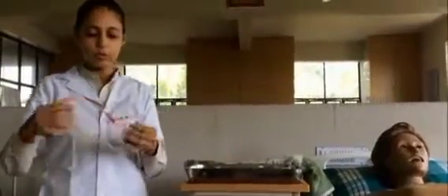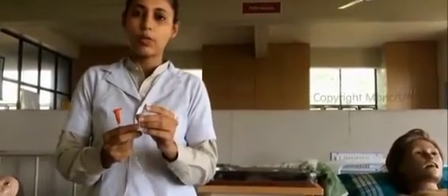Now the parts of the Ryle's tube. This is the tip of the Ryle's tube, this is the body, and this is the base of the Ryle's tube. The tip of the Ryle's tube is made up of radiopaque material, and along the body there is a radiopaque line. This radiopaque line is helpful to find out by X-ray whether the Ryle's tube is placed in the stomach or not. Now this is the tip. The tip is blunt to avoid injury during the insertion of the NG tube.